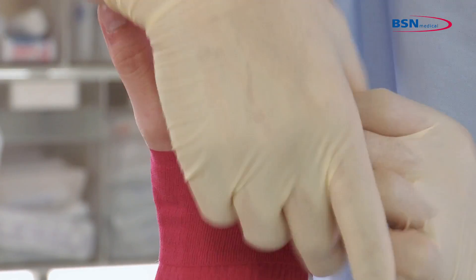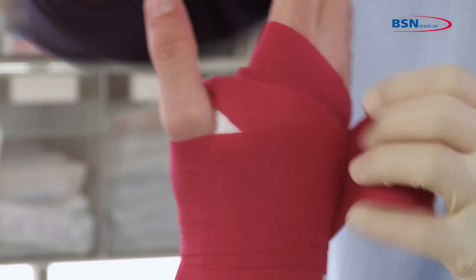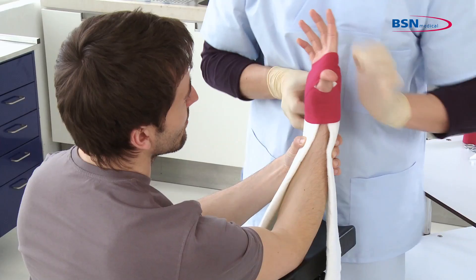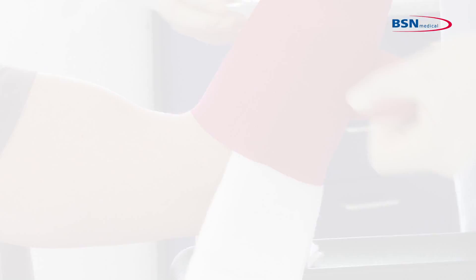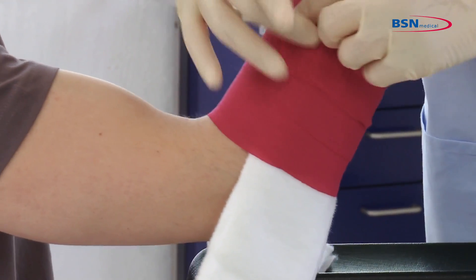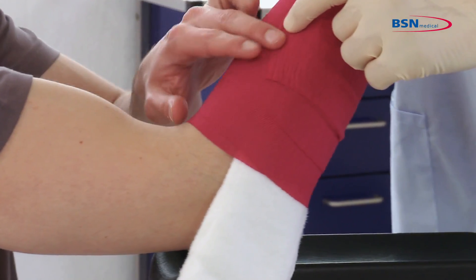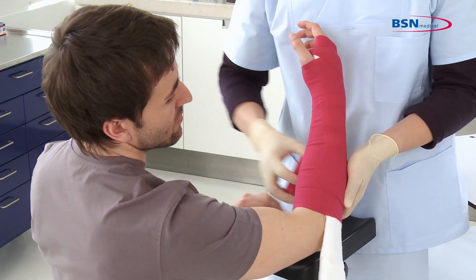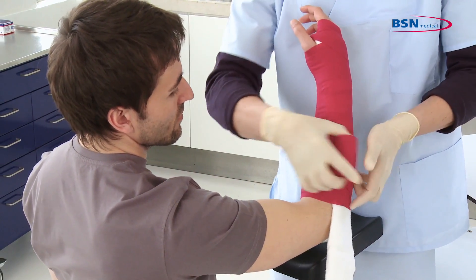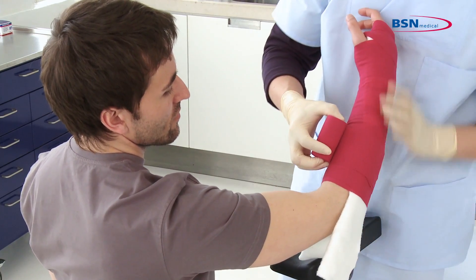Wrap with a bandage to secure the splint. Begin at the wrist and go through the web space. For better immobilization, repeat this step again. Proceed down the arm with overlapping 50% of the bandage. Secure the first bandage and start with the second bandage over the end of the first one.